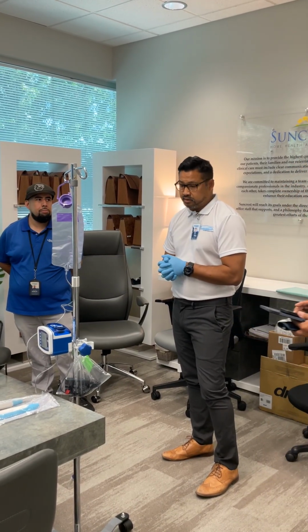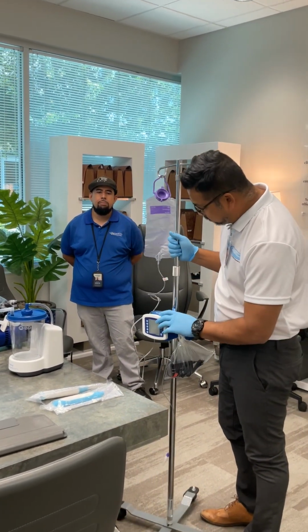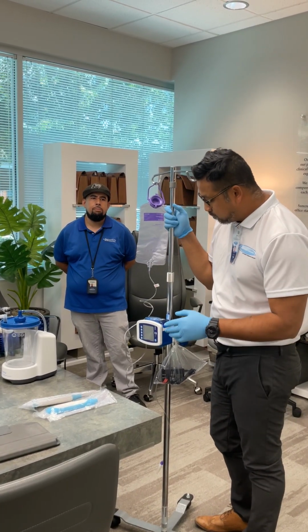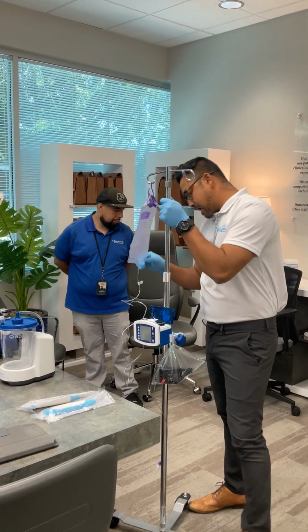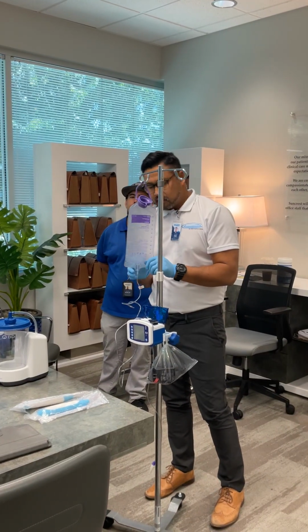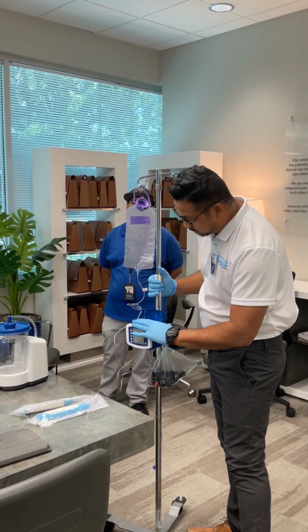Well, thank you, Sam. Appreciate it. So I think we're just going to start from this side and move our way that way. First item is a Joey pump. It's made by Covidien. So it's considered a form of enteral feeding. As you notice, there's an IV pole right here. There's a bag for your formula, whatever kind of nutrition you're going to give them. And then there is the machine itself.